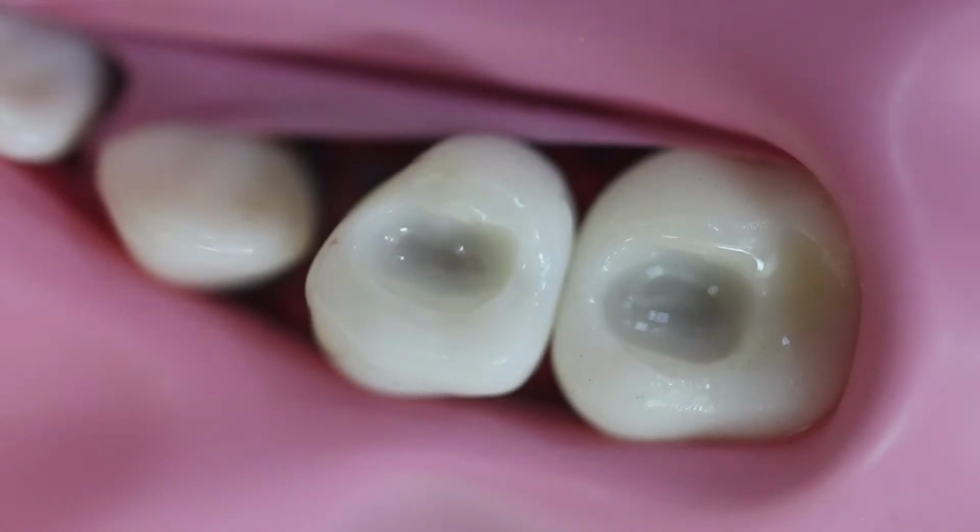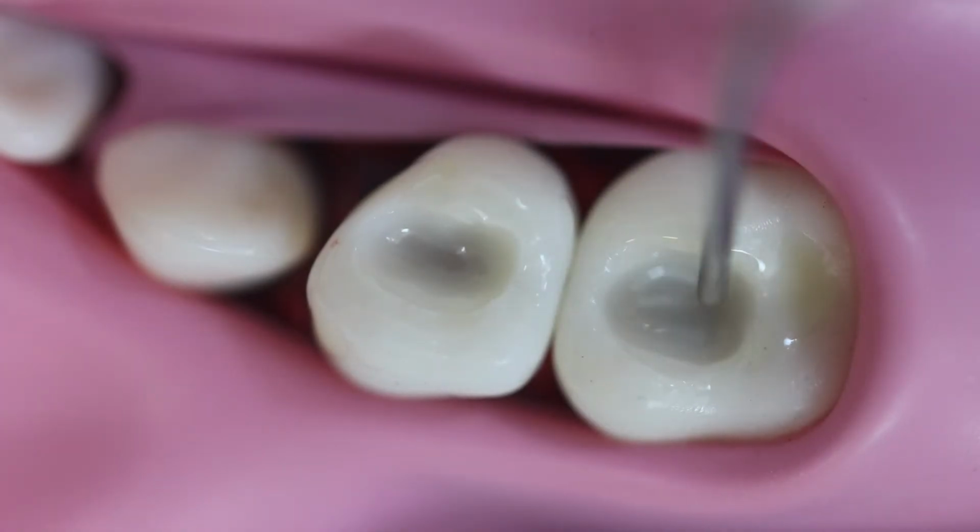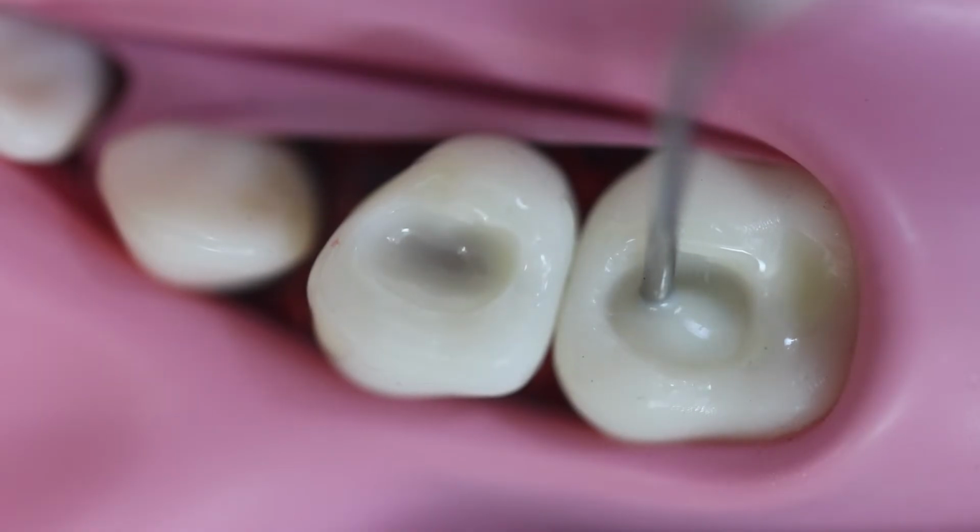Basically, for the first 20 seconds it self cures, and then we need the curing light to cure it. We use the Activa dispenser to dispense it. When putting it into the cavity, do not remove the tip, just let it flow.